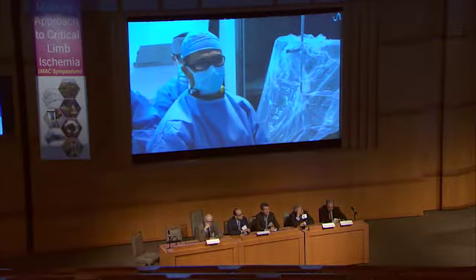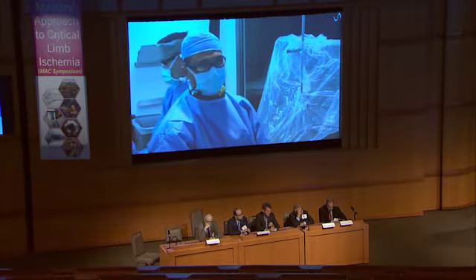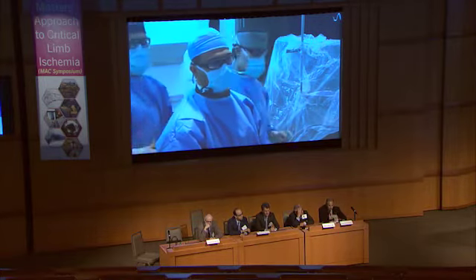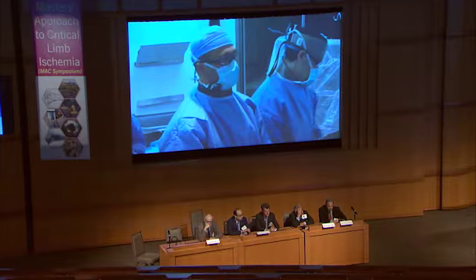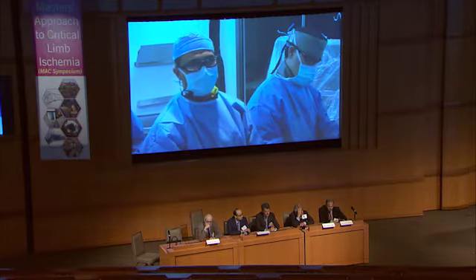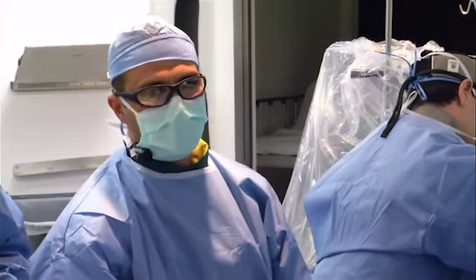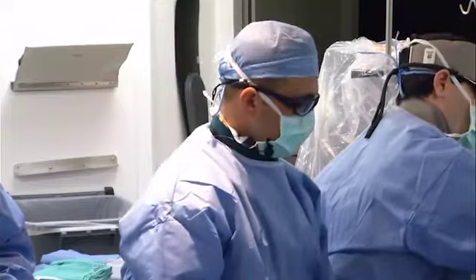So I think at this point, one of the techniques we have used in the past and something to show is to get a popliteal stick for a number of reasons. One is that it's going to help us to wire this retrograde, given the challenges that Andy described. And the second is that, once we are able to, God willing, cross the lesion and externalize the wire, I think we'll have a better rail to be able to get that sheath down, Craig.